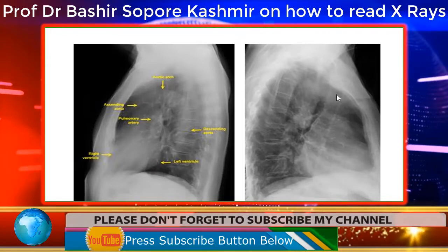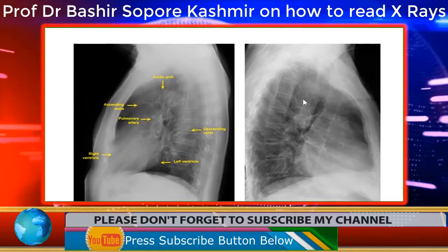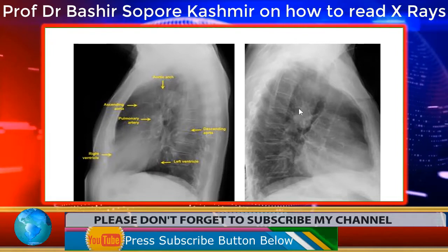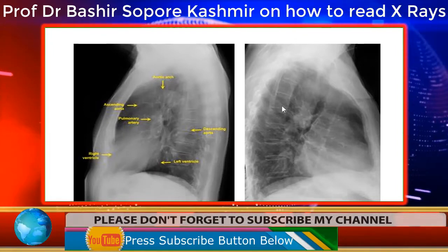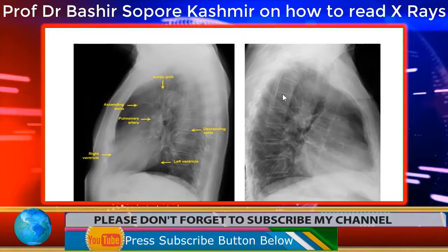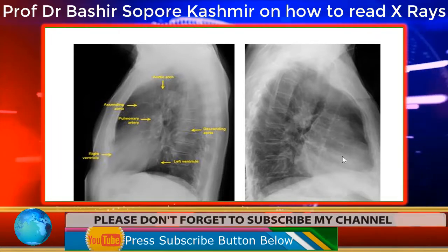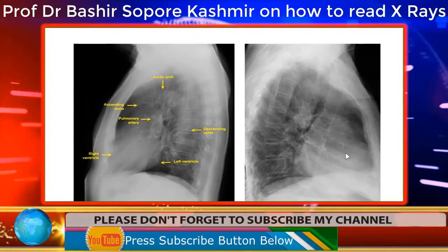And if you see the shadow here, it is coming like this shadow here. This shadow is the descending aorta, which is in front of the spine. This is the spine. These are the intervertebral discs. So this is the position of the heart on the lateral view of the X-ray.